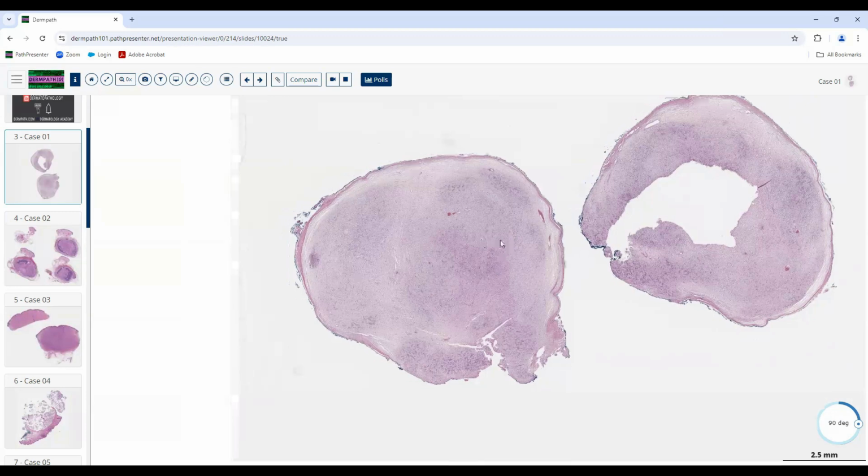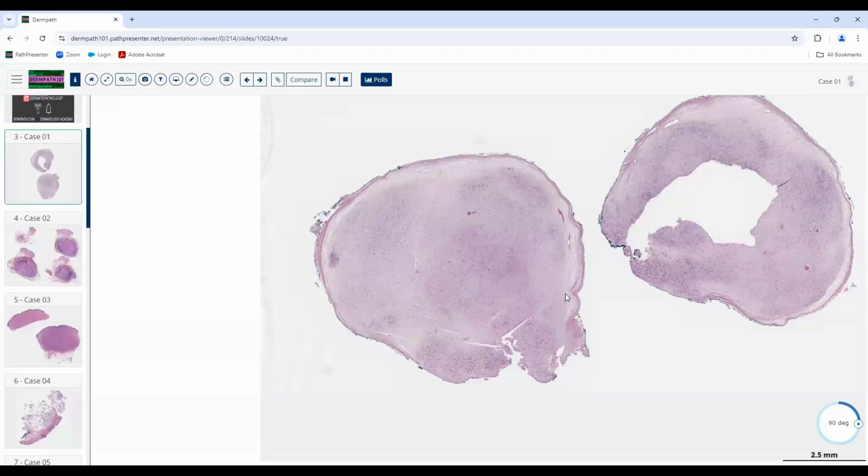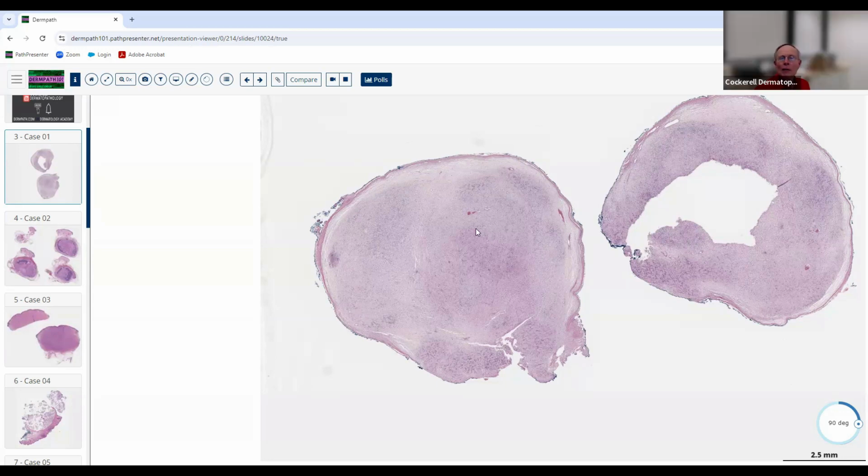And it looks neoplastic. Okay, good. I think it's pretty well demarcated and the shape is symmetric, although the stroma looks a little more disorganized. But overall, I feel like it looks benign. Exactly. At low magnification, pretty much symmetrical, well circumscribed, not tiny but not gargantuan. So relatively small, well circumscribed, symmetrical: all three major criteria for benignity at low magnification. Obviously, we can go to higher magnification and may change our mind, but at low magnification, I totally agree. It looks benign.